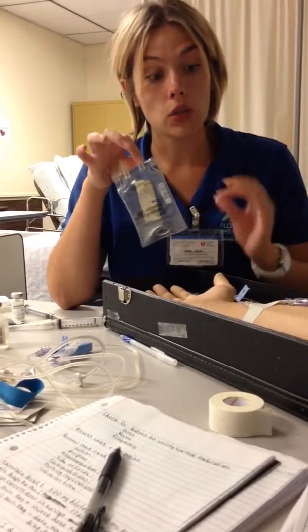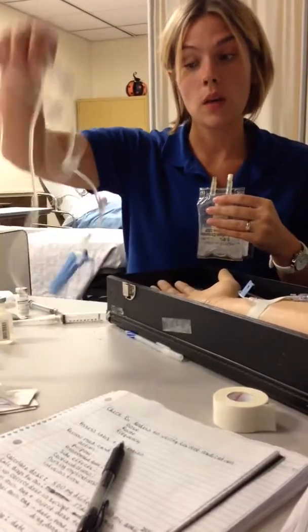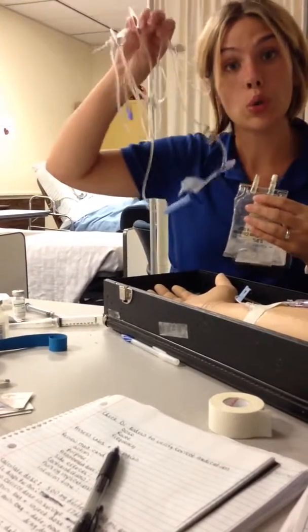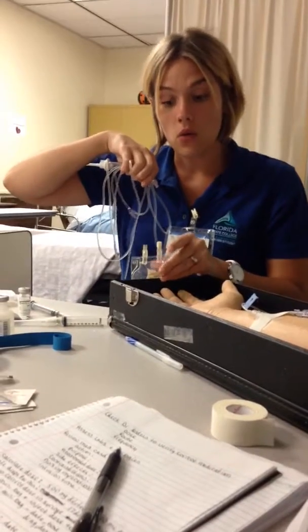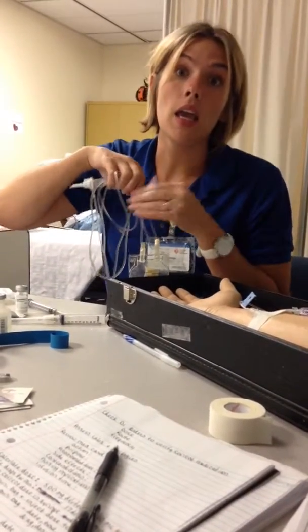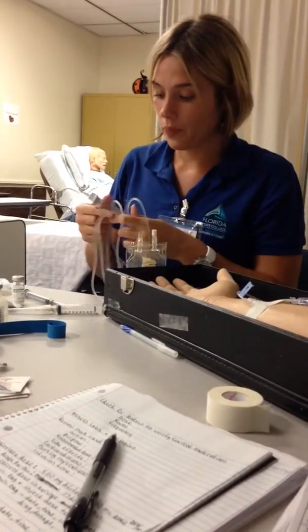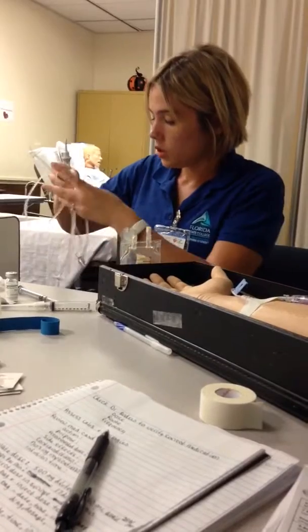Now in order to connect this mini bag to my patient's IV, I'm going to have to get my primary tubing, which I have here, and this is also sterile right out of the package. I'm going to keep this sterile where nothing can touch it, but I will disinfect the site again since it's hitting room air. Alright, I'm taking this out of the package.